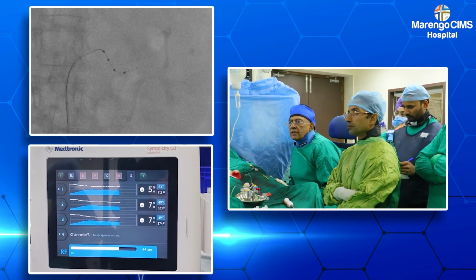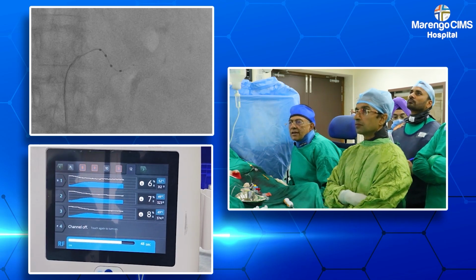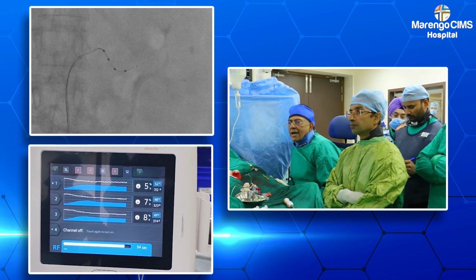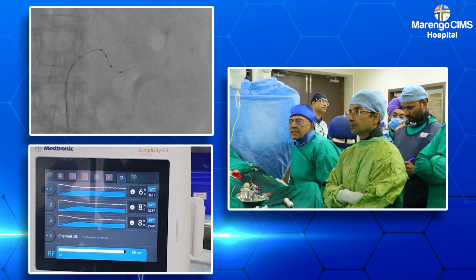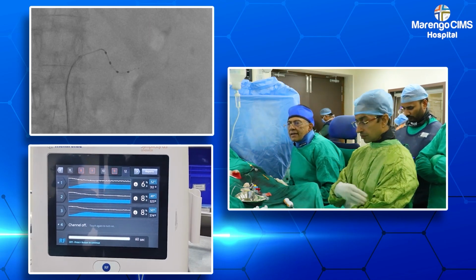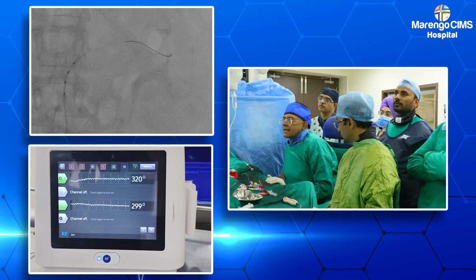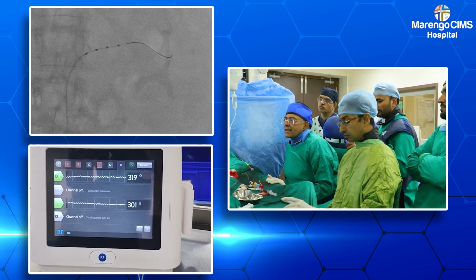We are talking of reasonably very large number of ablations, which I will tell you at the end of the procedure. And that is where the original study did not show success against the sham trial, whereas the later study showed success, and subsequent experience of operators has led to very aggressive ablation of as many large branches as we can find. So we reposition the catheter so that the first and the 3rd electrode covers the unablated area.